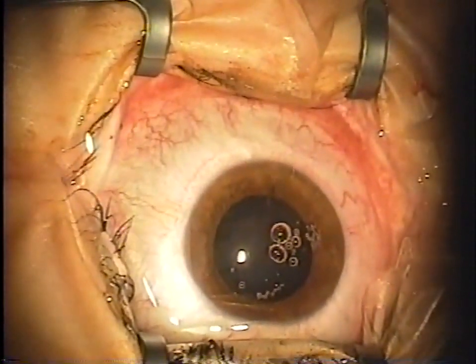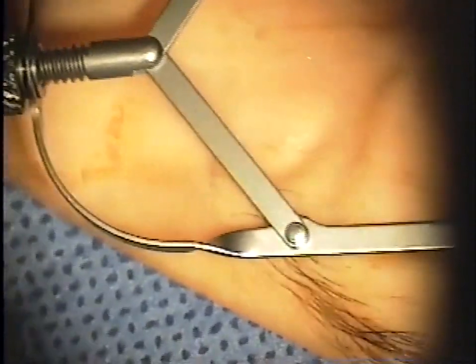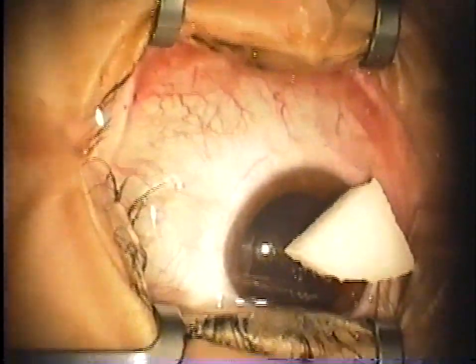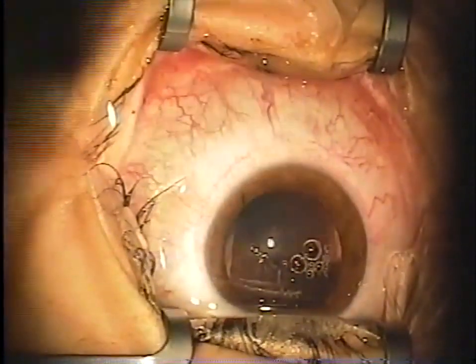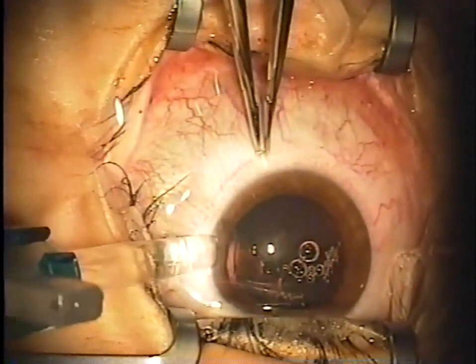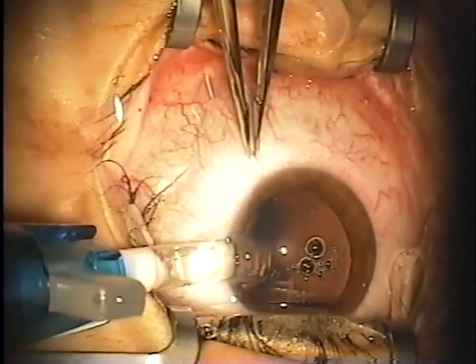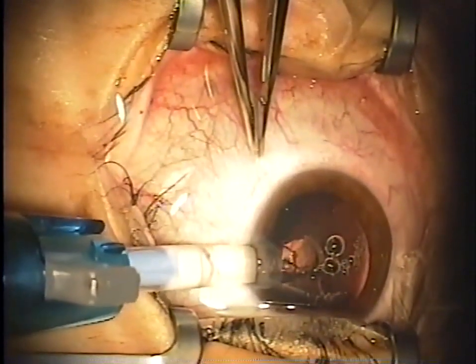At this point, the ICL is handed off the table, checked out of the vial and folded into the plunger-style injector. You can see here that there's a small piece of instrument wipe soaked in BSS. I found this to be the biggest help during the procedure, to keep the cornea nice and moist. Dry eye is the number one cause of blur in the first 24 hours with these patients, actually the first week. So next you can see the plunger-style injector is put into the wound and very slowly advanced.